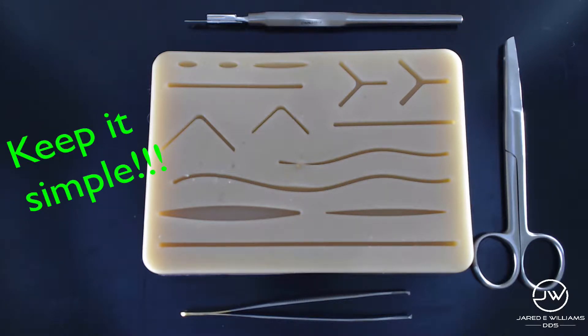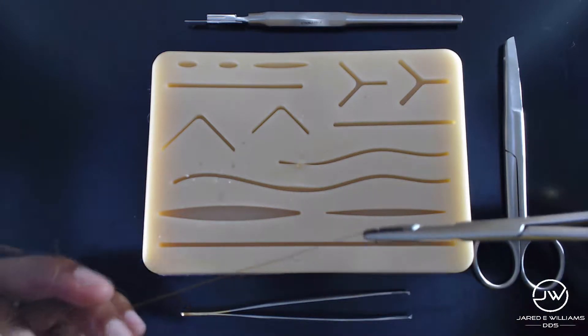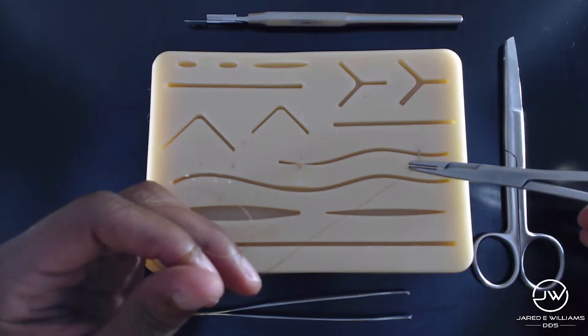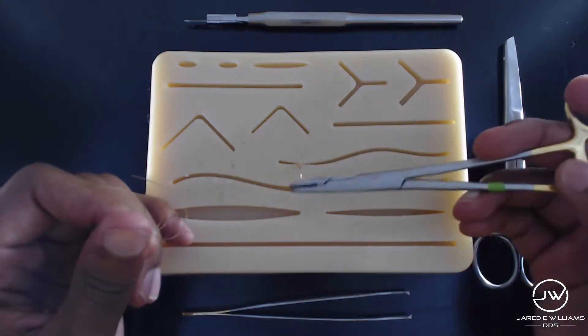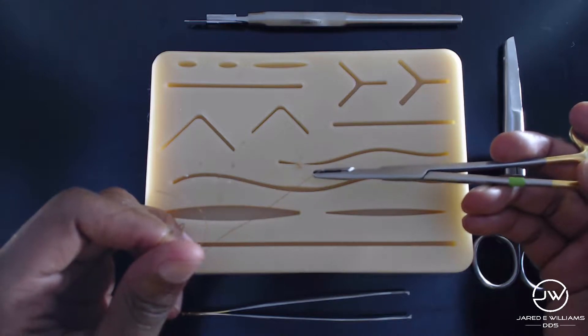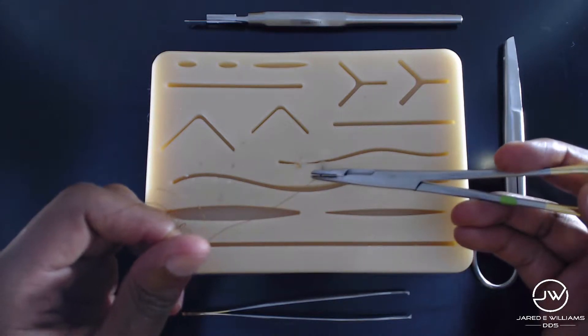So, once again, if you didn't see last week's video, go back to the other video and check it out. When we're talking about a continuous suture, we're going to re-approximate the tissues over a long span. We're going to start it just like our interrupted suture and we're going to grab two to three millimeters of tissue on both sides.